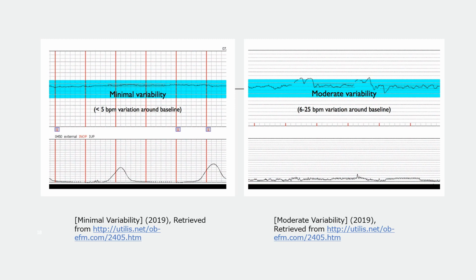Did the patient have a cigarette before she came in? What do cigarettes do? They impede oxygenation through the placenta. So you're going to see a flatter baby. You're going to see more minimal variability if they just smoked. Is the baby post-dates? Do we have an aging placenta? Something's going on. And we'll talk about ways to make it look better, but that's a couple examples where you might be worried about it or you might not. So you have to know what's going on.